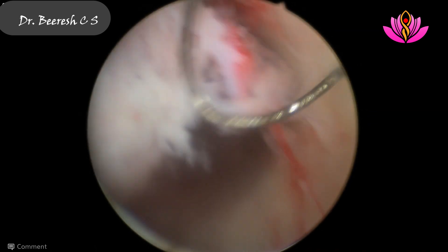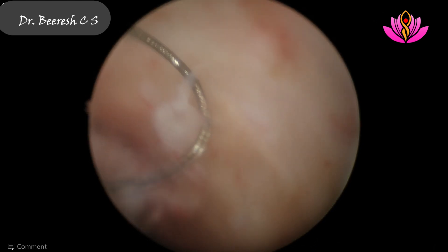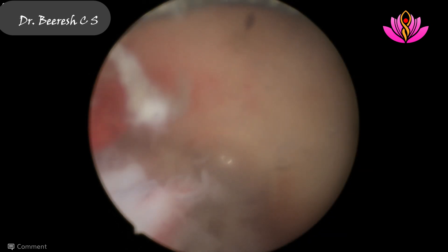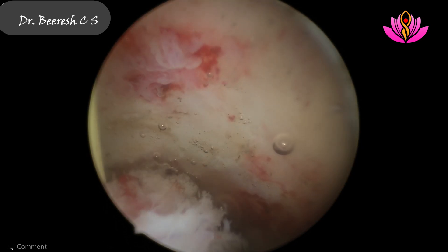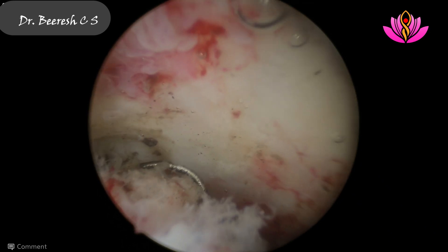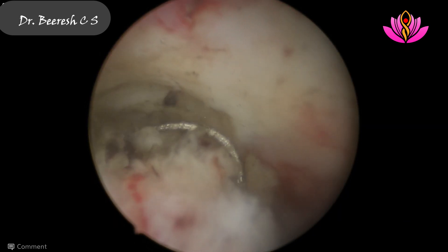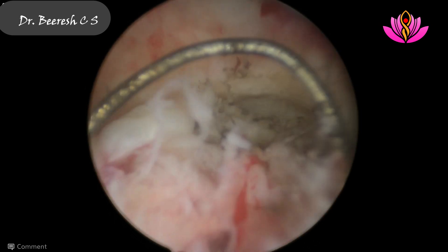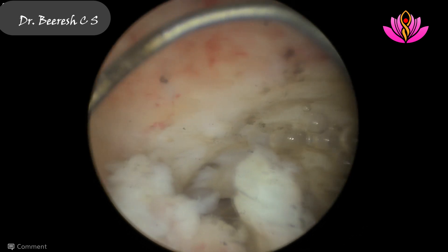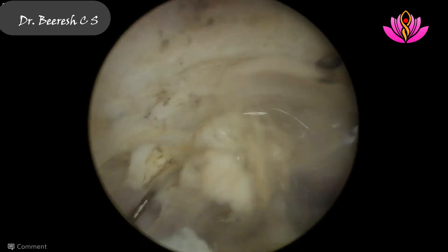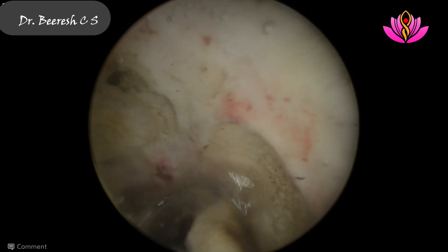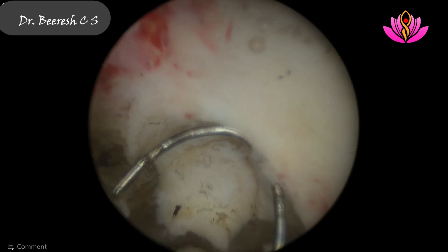The plan was to resect the scar tissue with the resectoscope, given its vascularity, and also to correct the isthmocel by flattening the proximal and distal edges so as to unify the cavity and the isthmocel pocket. I have used a 26 French monopolar loop electrode. With short bursts of cutting current, I am resecting the scar from the proximal ridge of the isthmocel region. With a gentle push of the loop, I could separate the trophoblastic tissue.